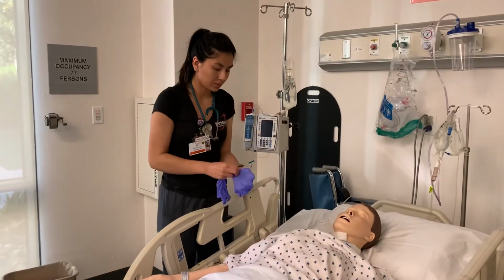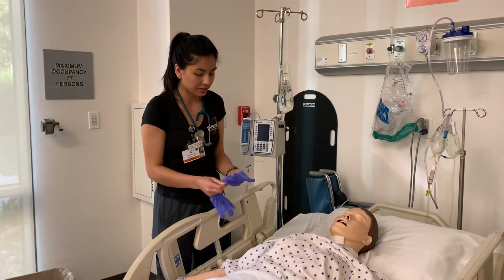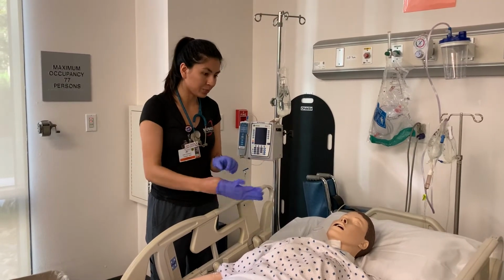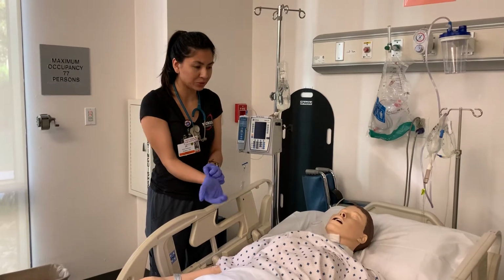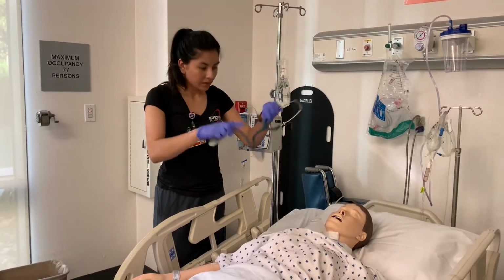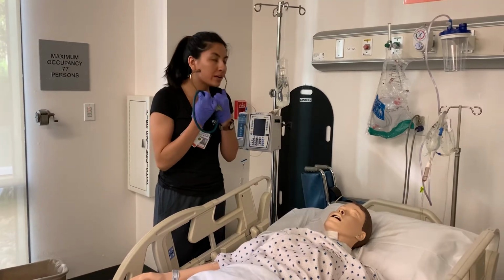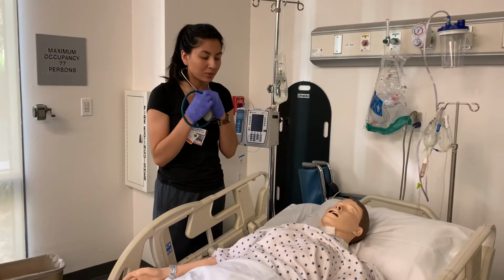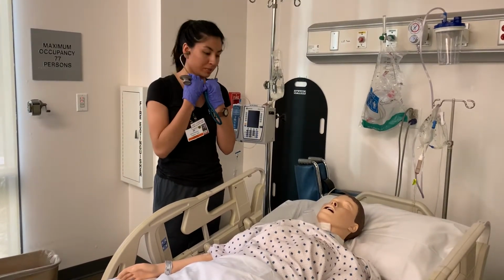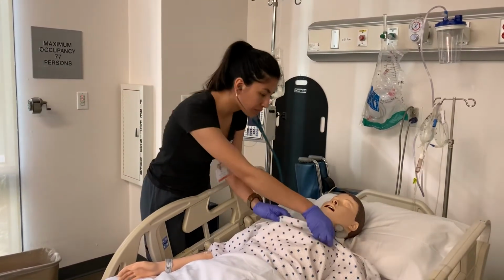So, Jane, I'm just going to take a listen to your lungs, okay? Okay. So I'm going to hook her up to O2 so I can have continuous O2 monitoring throughout the suctioning. And I would have checked in the chart beforehand what her baseline was to see if any crackles or anything was in her baseline, but I'm going to go ahead and listen as well. Exposure.